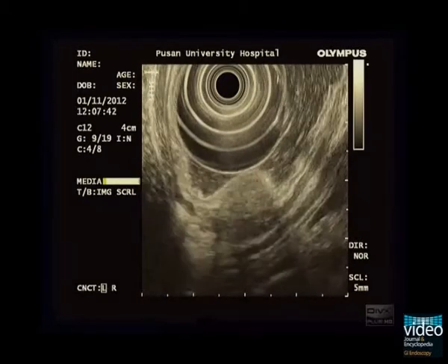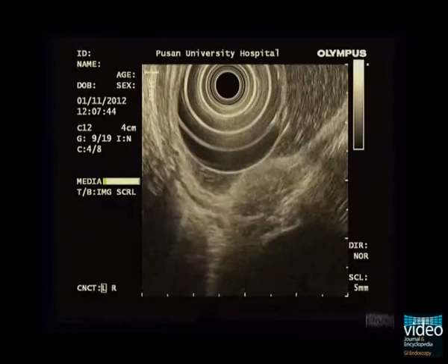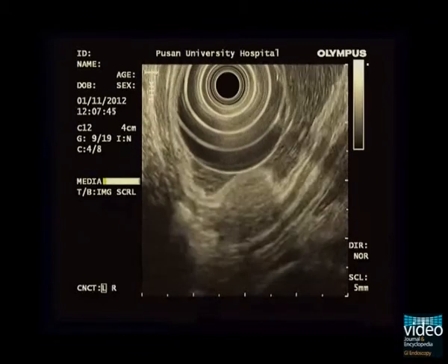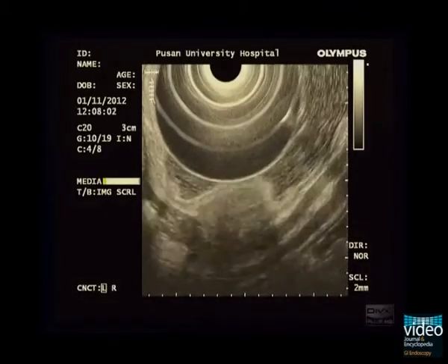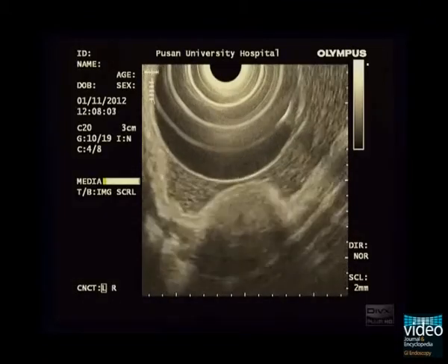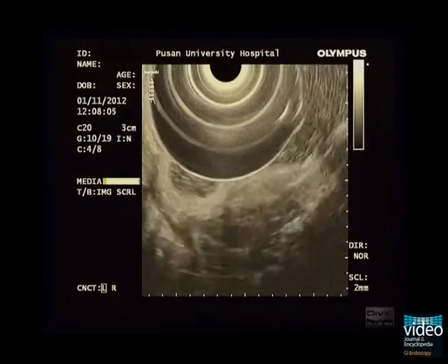In addition, a tiny duct-like anechoic structure is seen on the inner side. These findings are typical features of deep-type ectopic pancreas.